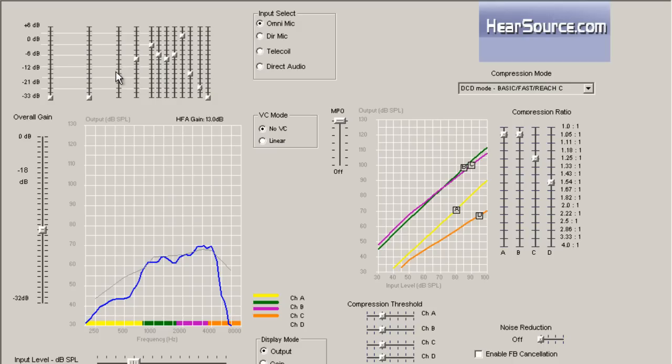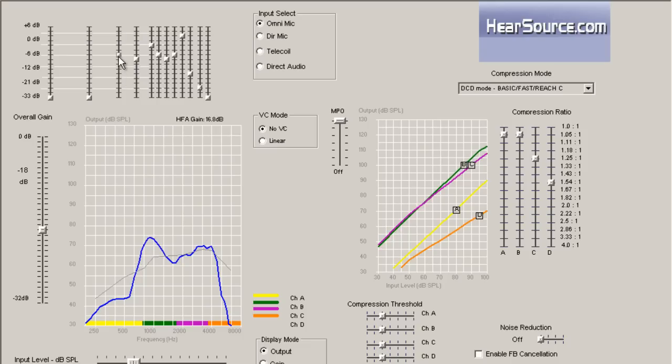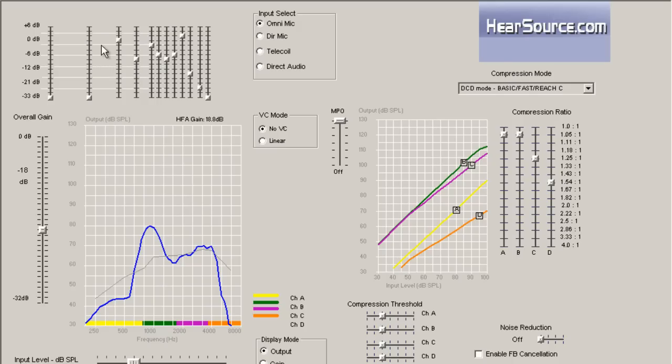Now to make sounds louder on these sliders, we take this button here and move it higher. The closer we are to zero decibels, which means full on gain, that's going to make things louder, or at least that particular frequency louder. To make the sound softer, you take the button and move it down.